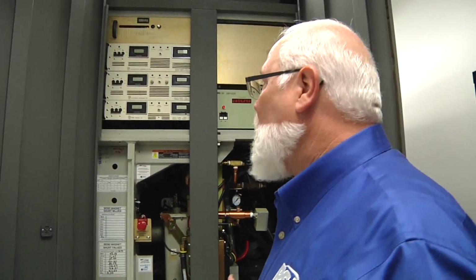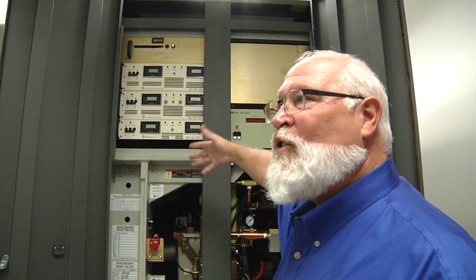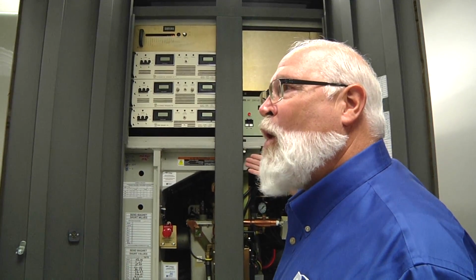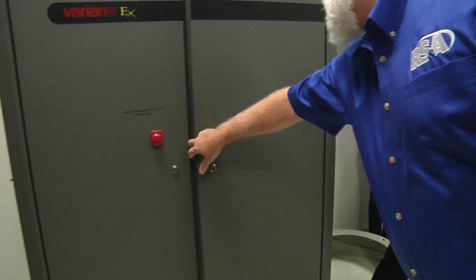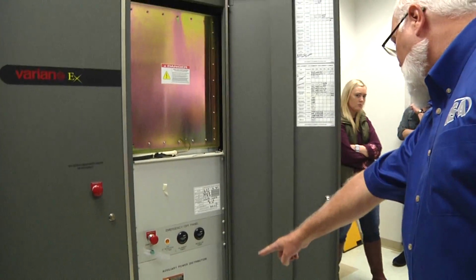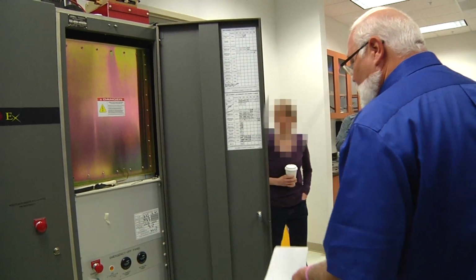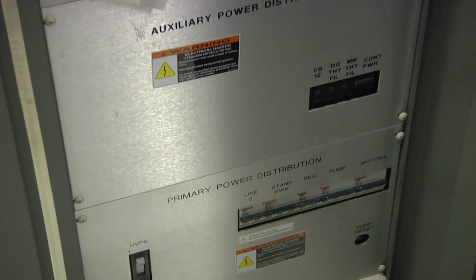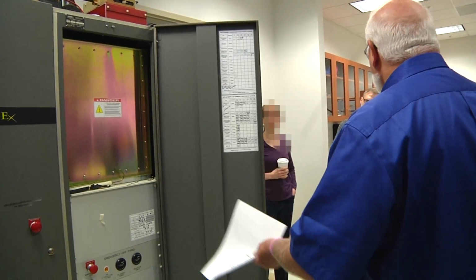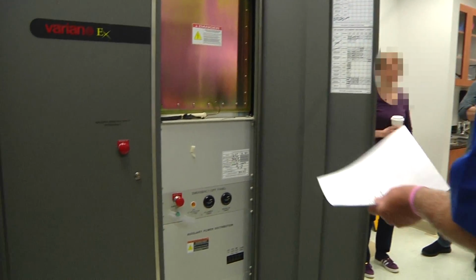Another thing, if your machine is shut off, all these circuit breakers, I have them shut down because this isn't a high energy producing machine, it just generates a lot of heat. Over here in your modulator, you'll have circuit breakers down here on the bottom. A lot of times we'll ask you to go check and see if maybe the motors on your couch aren't working. So I say, well, go see if your motor breaker is on. We'll guide you to areas of the machine that are safe for you to touch to go check stuff remotely.